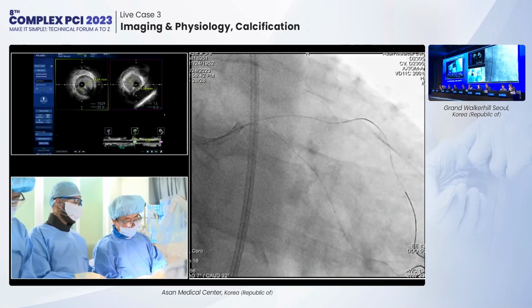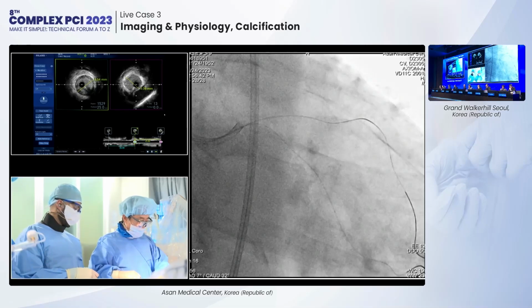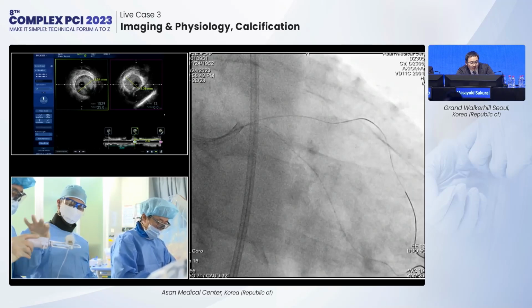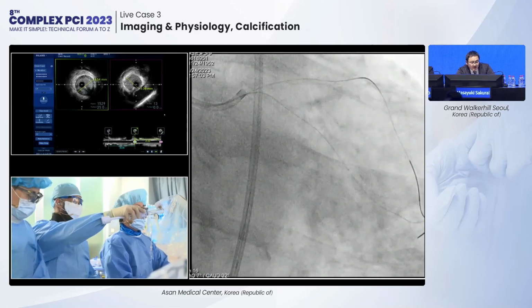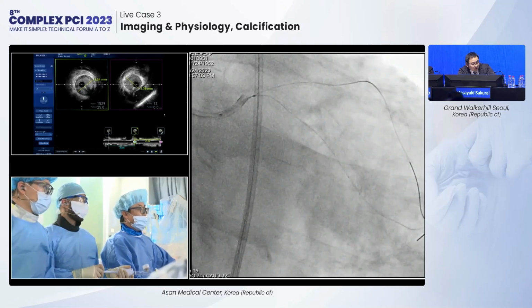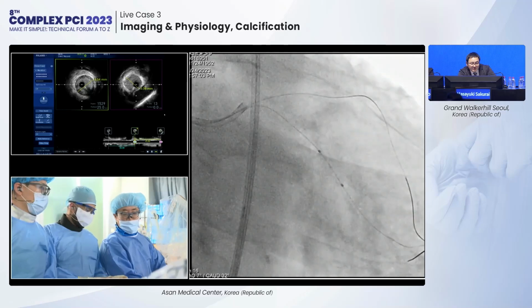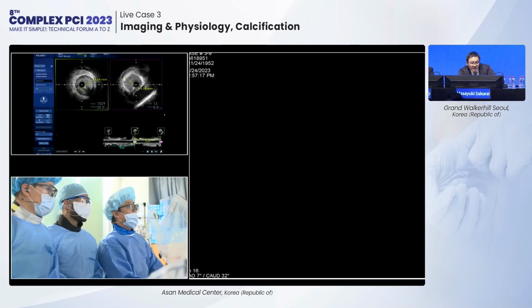From the angio, in the CX proximal, there is a severe calcification. So at first the IVUS did not pass. So first rotablation is performed at first. The LAD ostium has only calcification. So a big rota burr size ablation is performed.